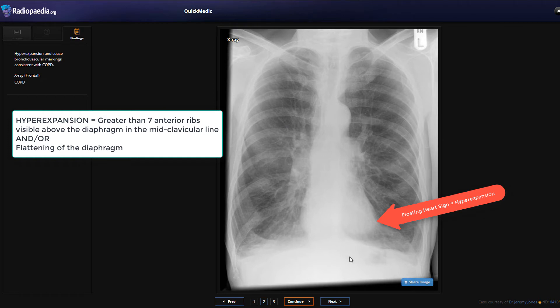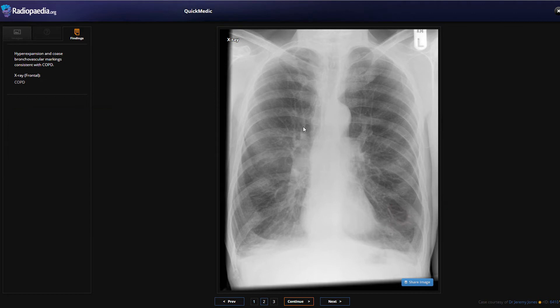The official report confirms this is a frontal X-ray of the chest showing the slender cardiac silhouette, flattening of the diaphragms, and coarse bronchovascular markings - all chronic changes in the lungs.